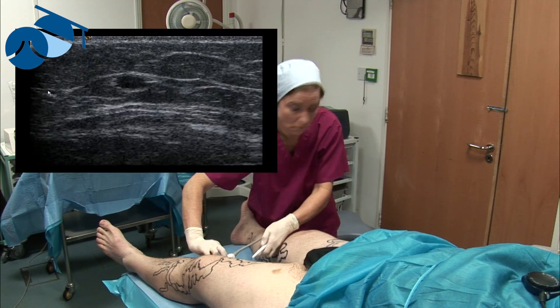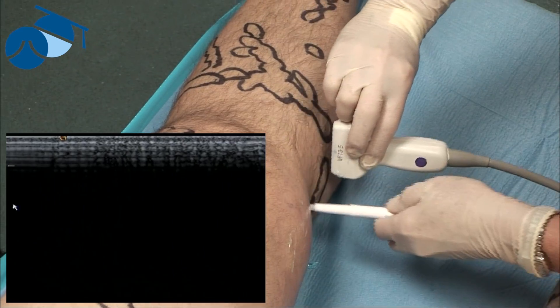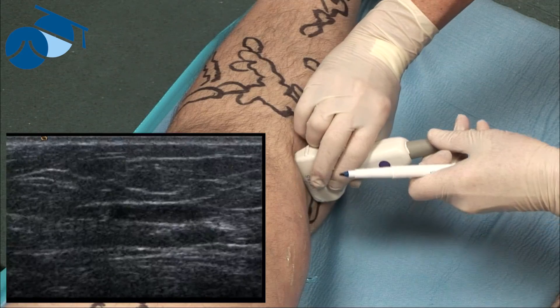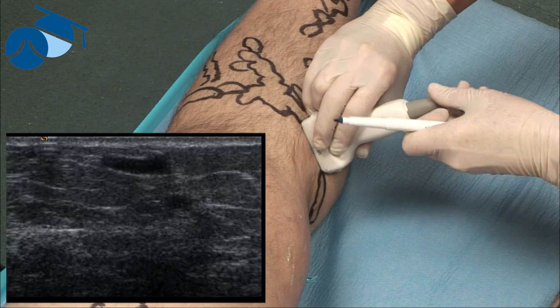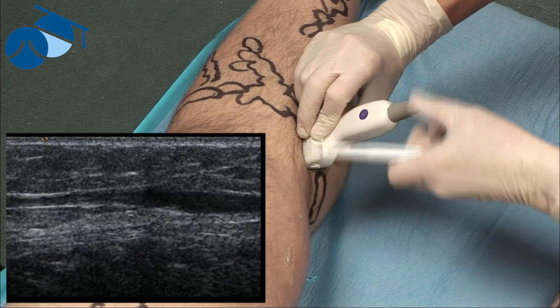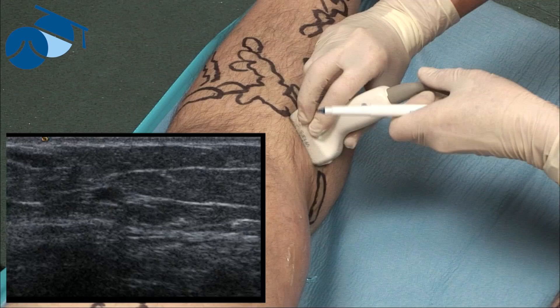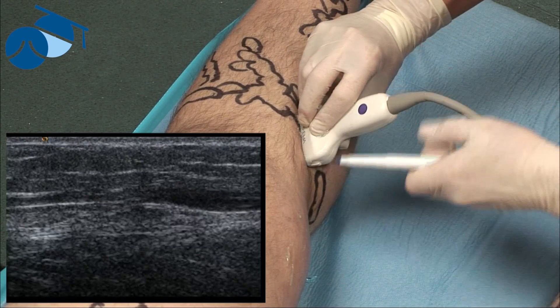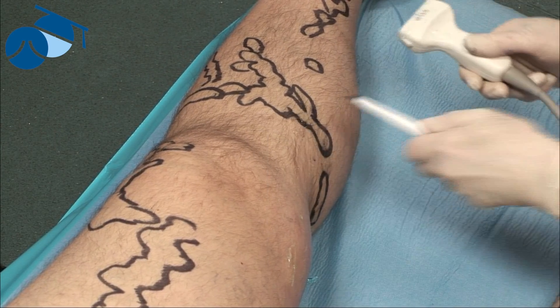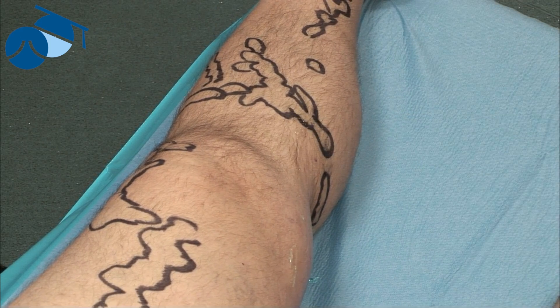The vein is coming to the surface now, so we're choosing the optimal point of entry for the surgeon — about that position there. There are lots of tributaries coming off; that's the longitudinal view, which is quite nice to cannulate. We'll mark that as the end of the marking and also the beginning of the endovenous surgical point — that's the entry point we've selected.